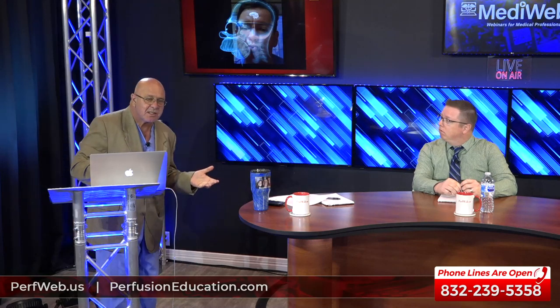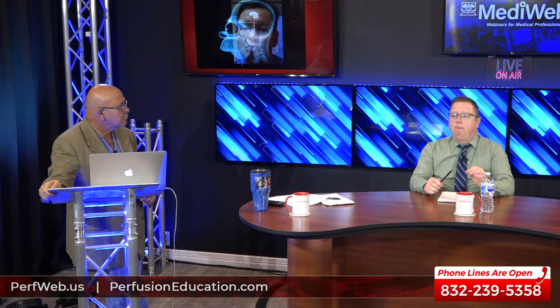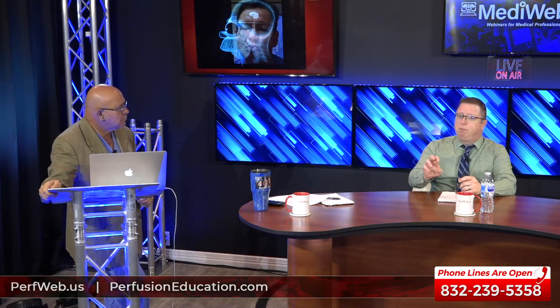So let me ask you this. When the surgeon says to you, come down on your flow, he's going to put the clamp on. Right. Come down on your flow. What do you do? Generally, I partially clamp the line. Okay. There are times when my hands are busy, I'm doing other things, because it always happens when I'm doing other things, whether it's coming on, clamp off. So there are times when I clamp the whole line. But generally I try, and I've actually changed now lately to trying to bring the pump flows down as well.